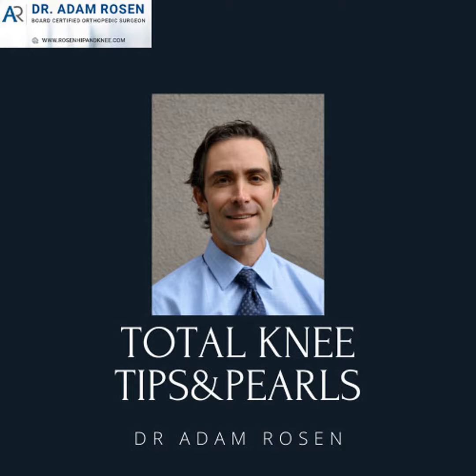Even an ankle injury, does it include a tib-fib? Can you see the proximal fibula? All of these things are things that you're speaking to the audience or your upper-level residents or your attendings, but it's also making your brain think, what are these things that I have to be thinking about and looking at?